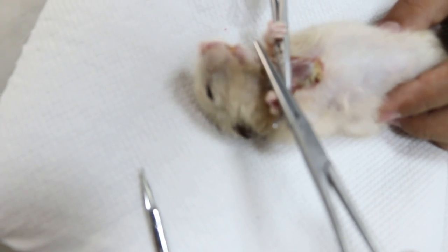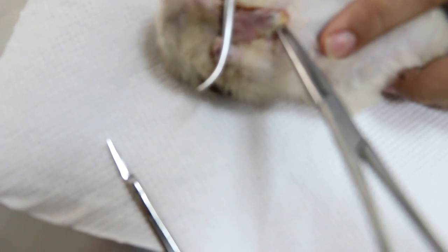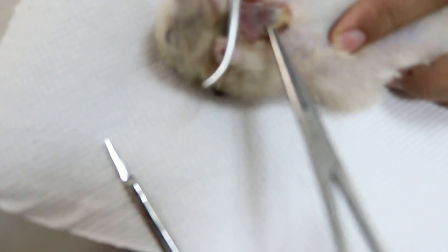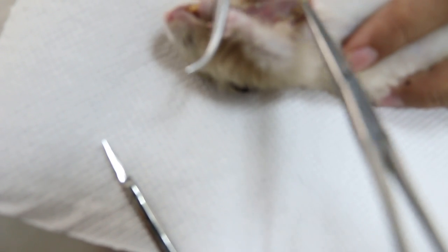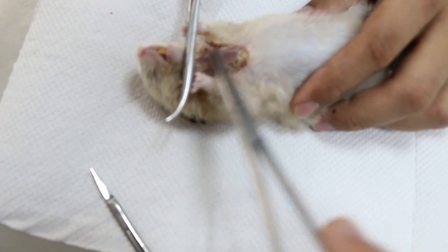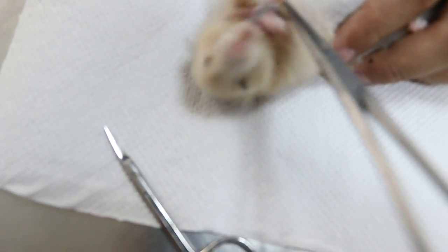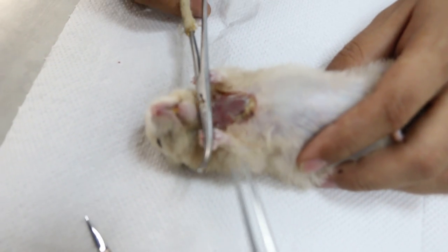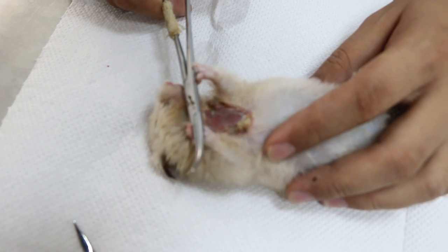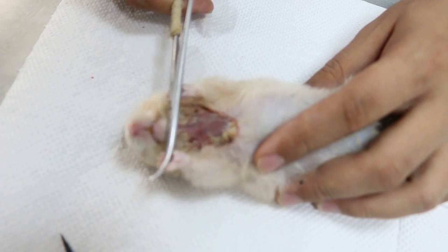To do that you need two people — one person cannot do the job. Normally under anaesthetic, all this dead skin will be cut off, and then the wound is clean so there will be less smell. So now I'm going to do it, and that's how you treat an infected neck wound which is a big wound: debride and give antibiotics and injection.